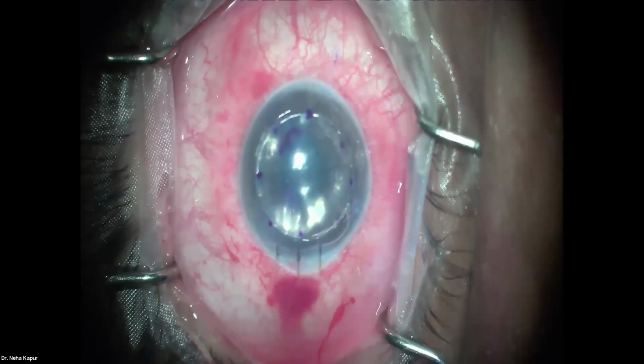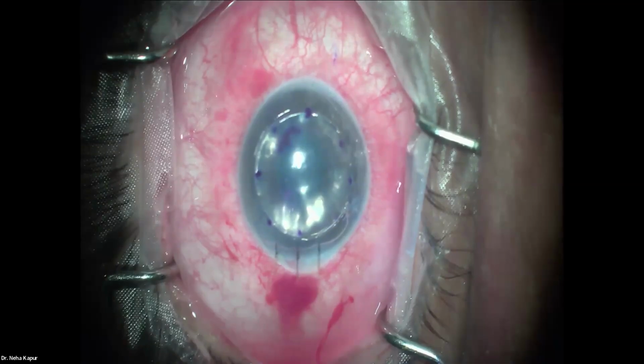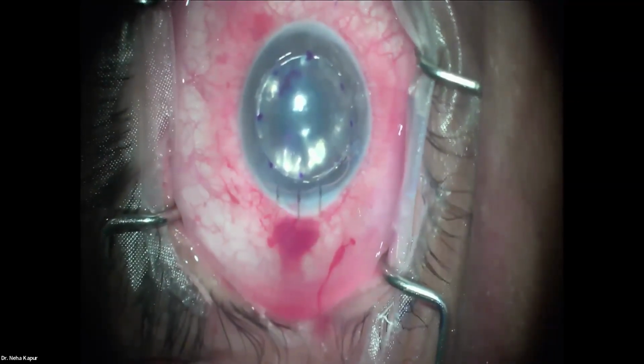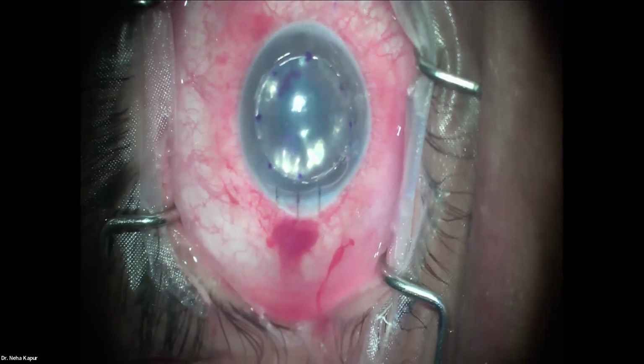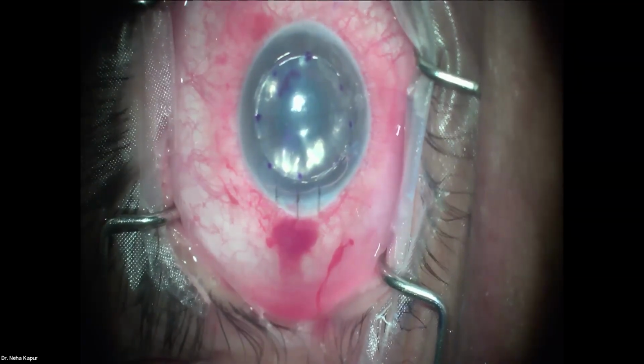Is the glide always necessary? Well, you do need something to put the tissue inside the eye with. Like we discussed with other maneuvers, you could use a Sheets glide, or the Busin glide, or any of the other tissue inserters like an Endoserter, TANS and Endoglide. There are quite a few available.